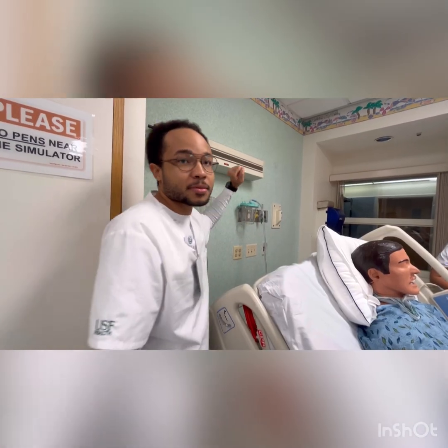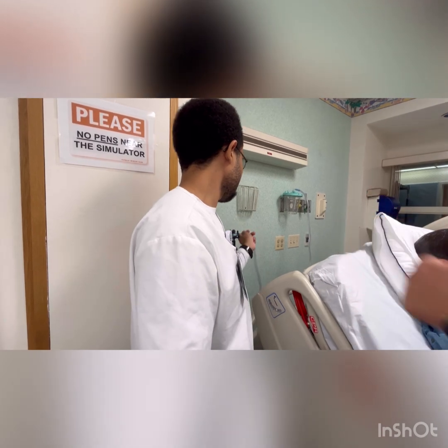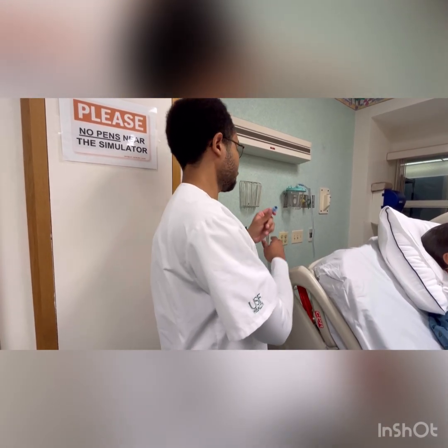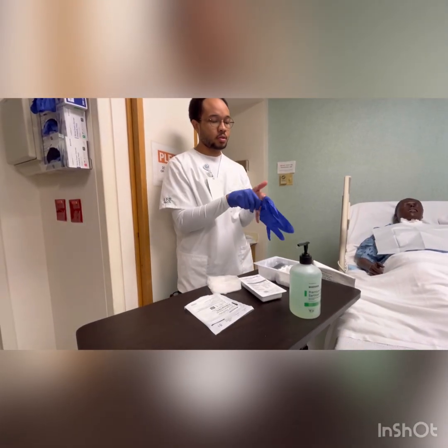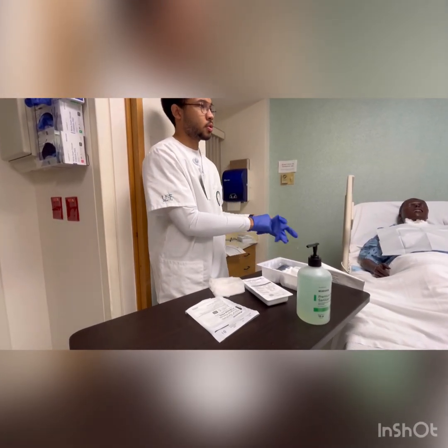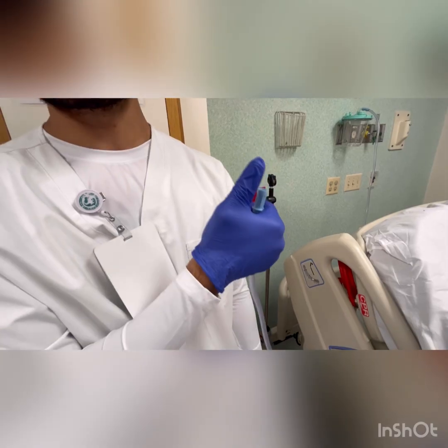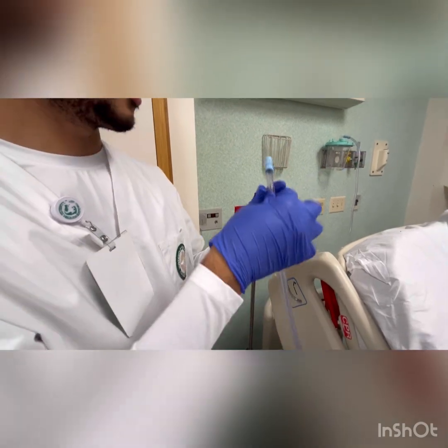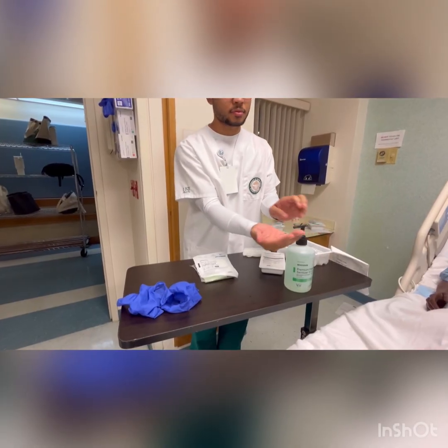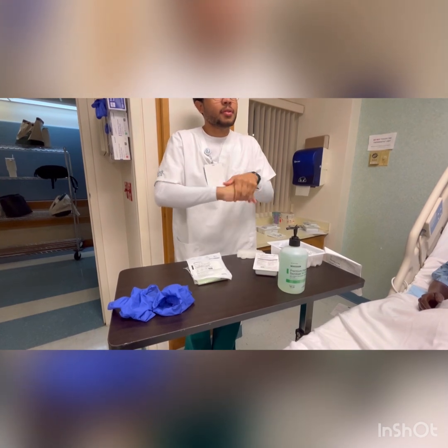Next, we would go to the wall and turn on the wall suctioning or the portable suctioning machine and adjust the pressure regulator according to the agency's policy. Then after that, we would don non-sterile gloves and a face shield or goggles. And then we want to test the suctioning equipment by occluding the connection tubing by putting our thumb over the port. After that, we would remove and discard the non-sterile gloves and perform hand hygiene.